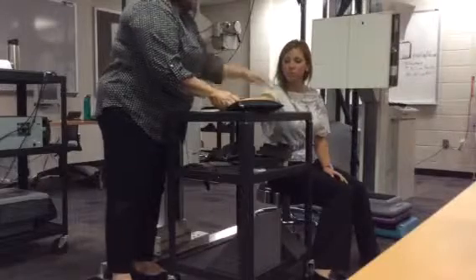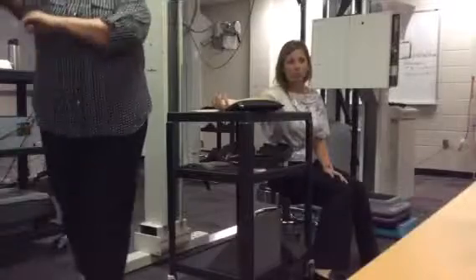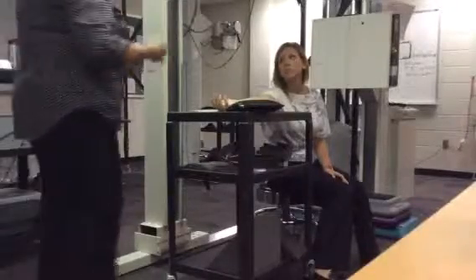If you were doing the proximal, then you'd be 1.5 inches from the edge of the film from the elbow joint. Okay, you can relax. Any questions about AP forearm?